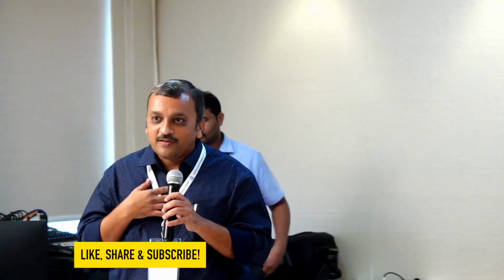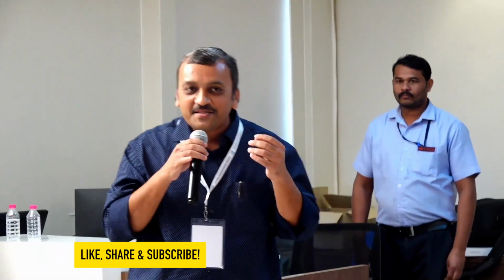Completely agree, sir. And there are two aspects to it, and we will further add to it, sir. One is, the next talk we are talking about is lung protective ventilation. And one of the important things we talk about in lung protective ventilation is atelectasis. It's a severely underappreciated complication of anesthesia. When you keep an expiratory pause and without an adequate PEEP, you are tending to cause some amount of atelectasis. So that becomes a problem. Whatever you are achieving with lung protective ventilation, partially you are negating with it.